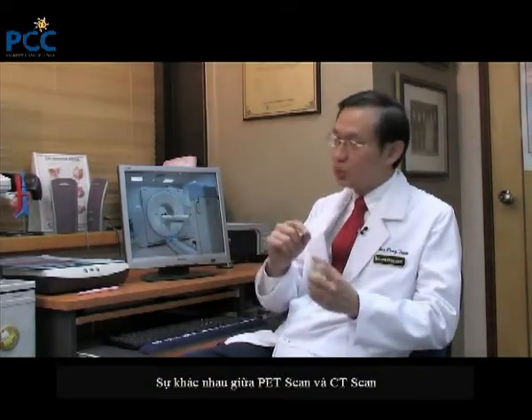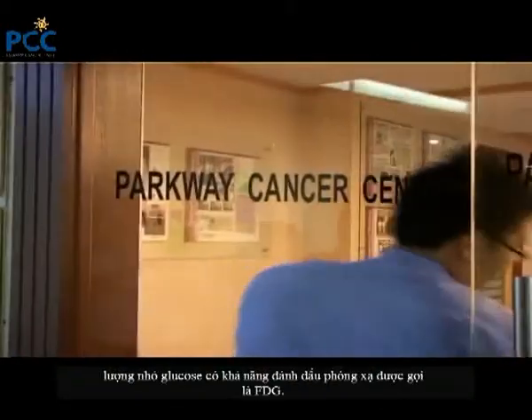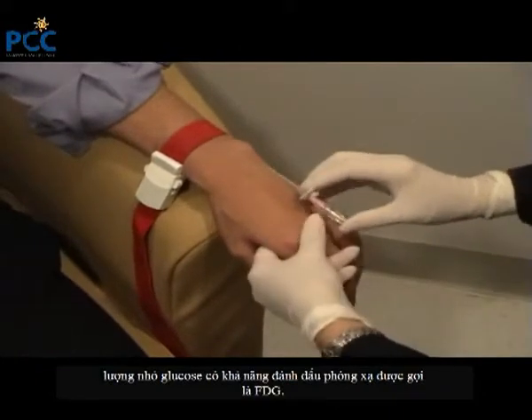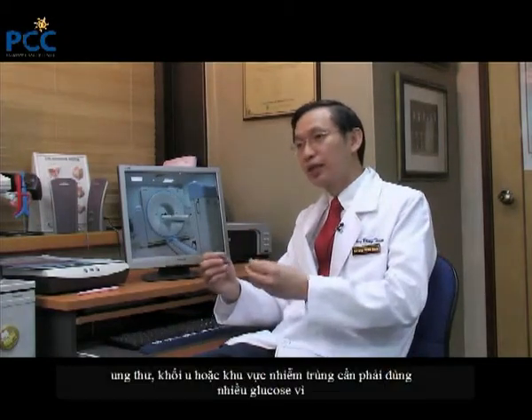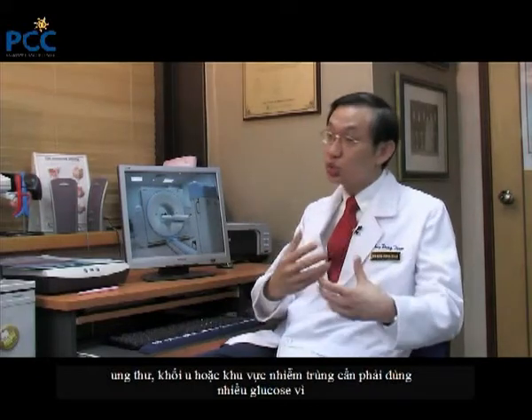The difference between a PET scan and a CT scan is that in a PET scan, you inject a tiny amount of sugar, a little bit of glucose, that is tagged on to a radioactive substance called FDG. All right? And we know that when you have an infection or you have cancer, the tumor or the infection needs to use up glucose.